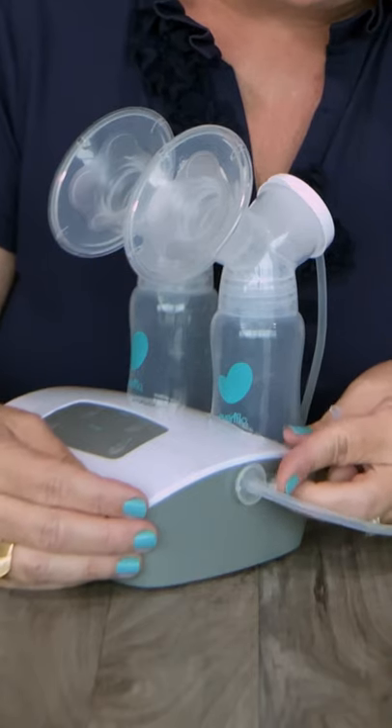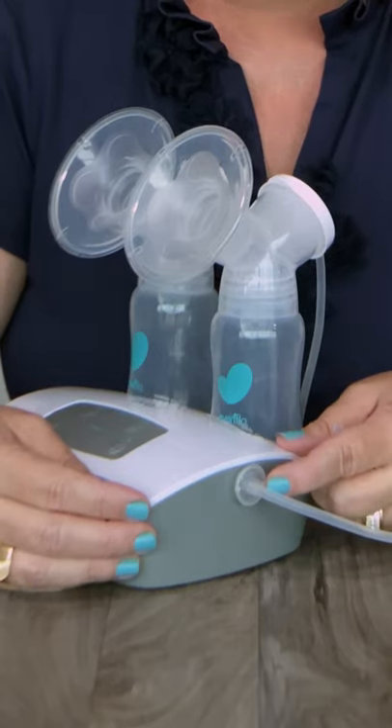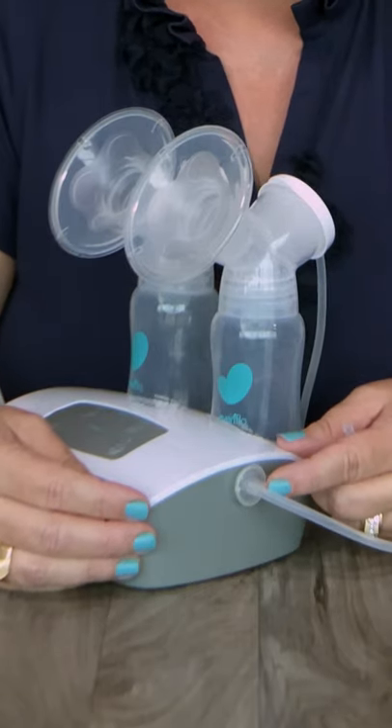Second, make sure that you are closing off one of the tubing adapter sides if you're using your pump as a single pump. Third, make sure that you have inserted the diaphragm into the flange.